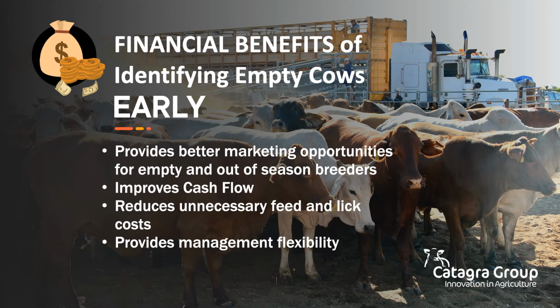An early preg testing program can also contribute considerably to the long-term genetic gains within a herd. With the use of animal ID software, individual animal lifetime performance can now easily be recorded and measured. Poor performing breeders can be identified and removed from the herd.